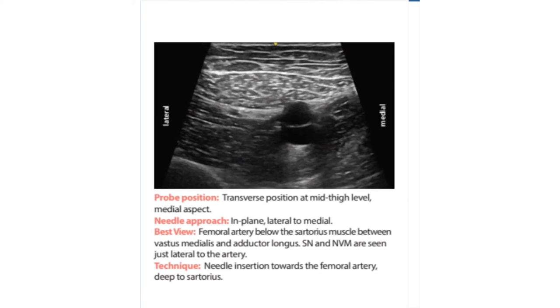The femoral artery is just below the sartorius muscle, between the vastus medialis and adductor longus. Local anaesthetic is deposited deep to sartorius and lateral to the femoral artery.